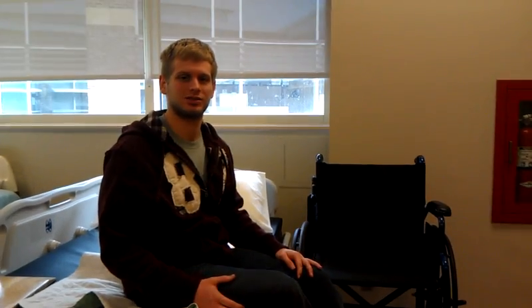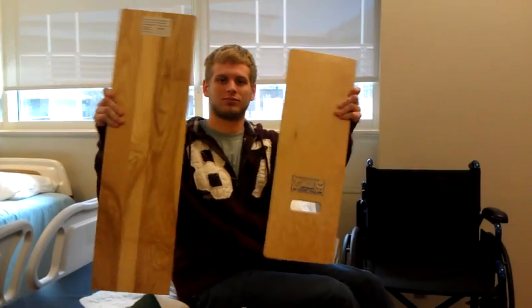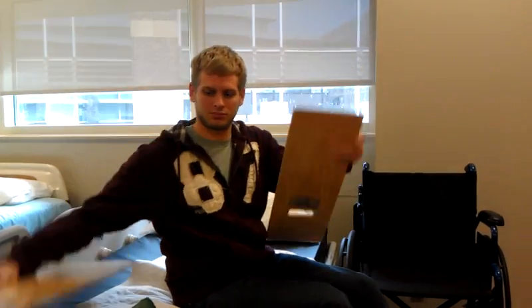There are many different types and sizes of transfer boards, so determining which board works best for your client can make the act of transferring easier.